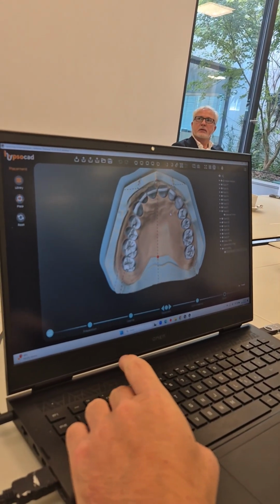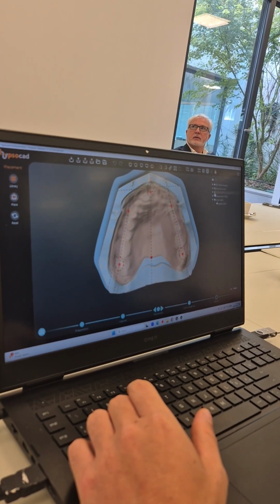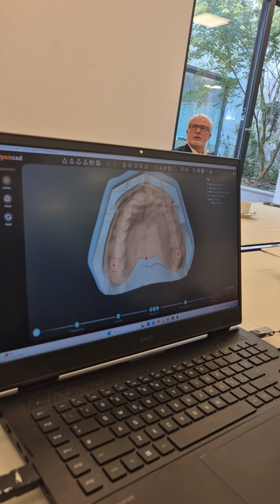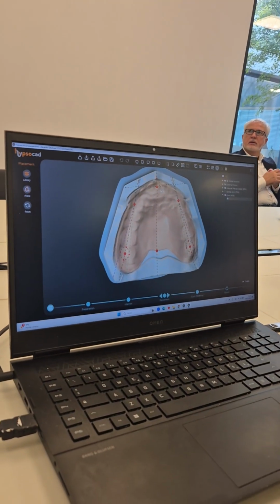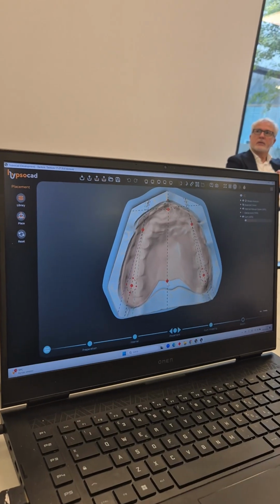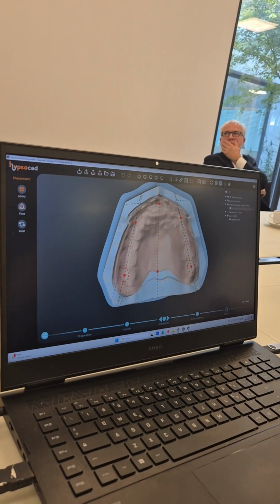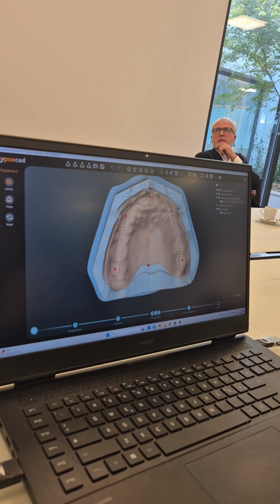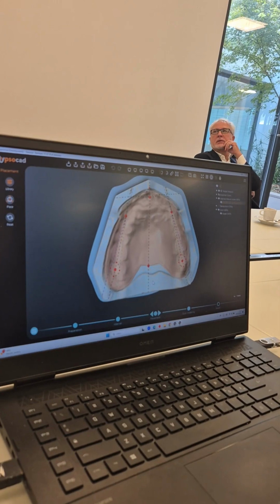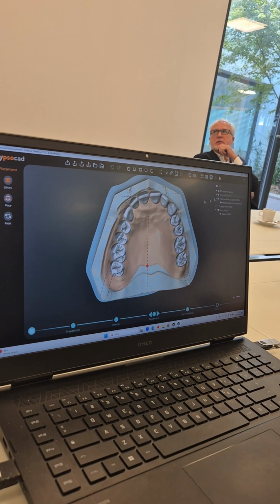Step, you need to select the correct part of your model. For example, you need to analyze the model. You need to select the incisor part, the trigons, the foveal points. Automatically the software chooses a correct library. For example, I select the point, and automatically it chooses the correct dimension of your teeth. And in the placement, it places the teeth.